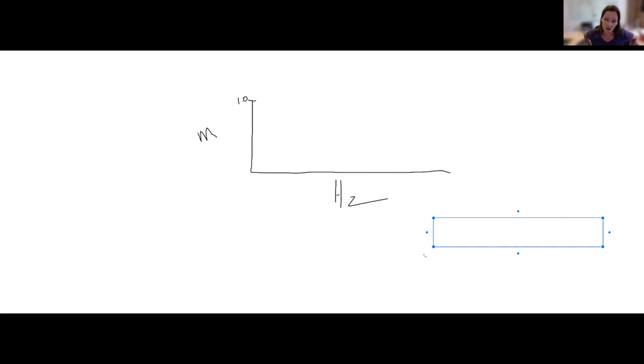Another source of noise that you might encounter is interference from some kind of radio signal. We've had this problem when we had a very strong local radio station near our lab. And so we were picking up the actual radio broadcast signals in the EMG recordings, which is a real pain. They were so big and so strong that they made a new building where the entire building was turned into a Faraday cage to try to insulate from those signals.